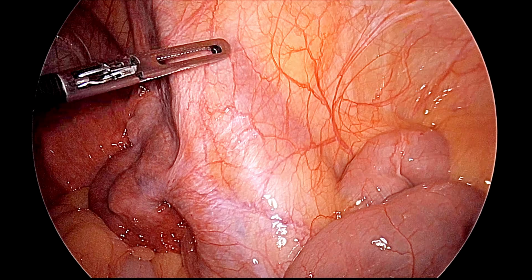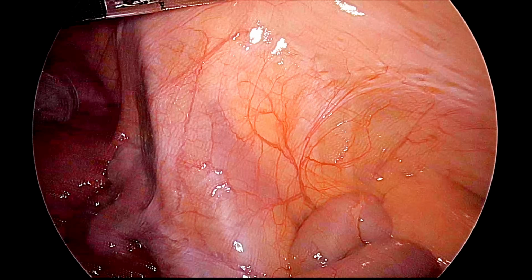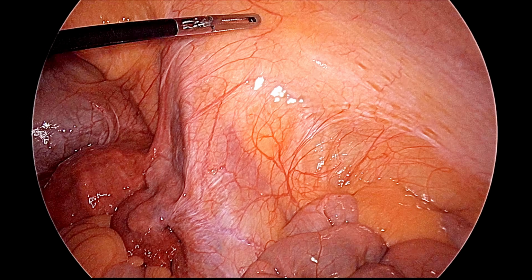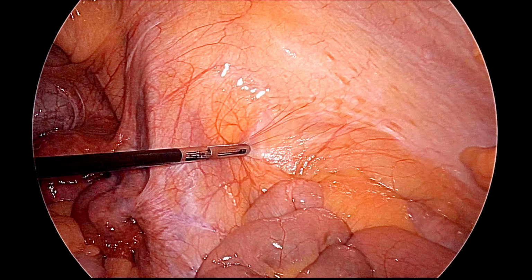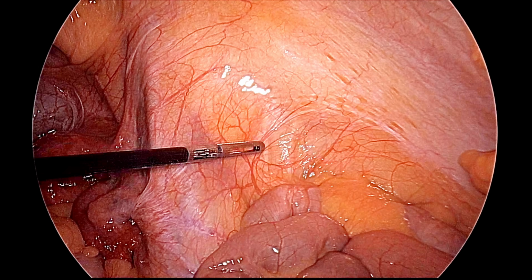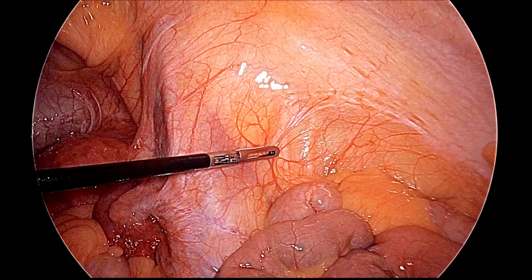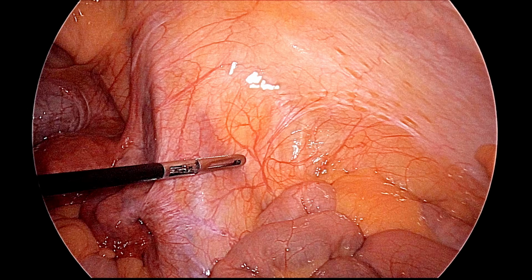And laterally you can see the LFCN, the lateral femoral cutaneous nerve of the thigh, and this area is called the triangle of pain. If you injure it, you will have pain on the lateral aspect of the upper thigh and the skin around the hip joint. These are the nerves which are going there. So this is the triangle of pain area, which you also have to be careful not to injure.